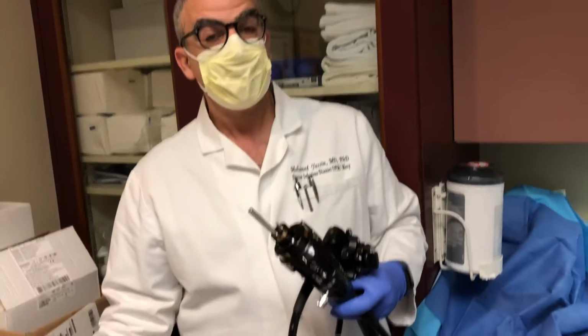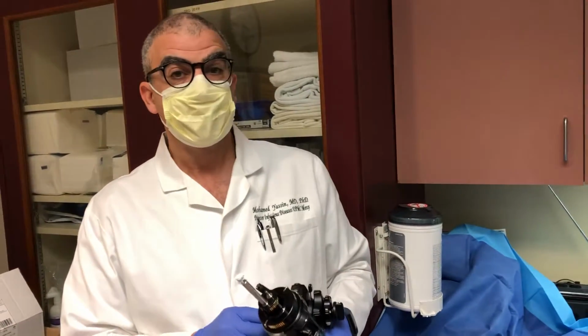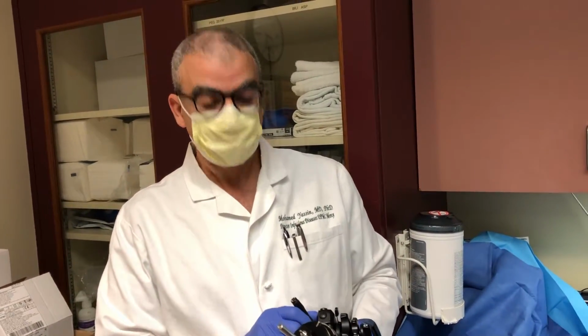So we move the elevator channel up and down to make sure the blade is movable, and we brush carefully with this brush, and we cut it in the same fashion as we cut the other brushes to make sure we recapture that. There's no need for that in this particular scope, but for ERCP and EUS, you may need to do that. Okay. Thank you.